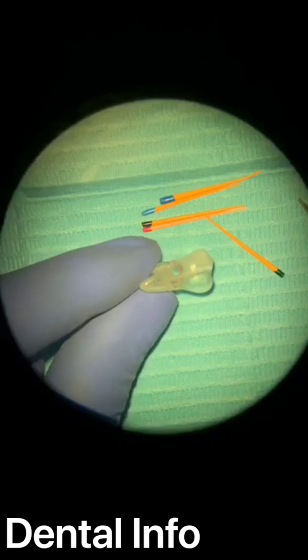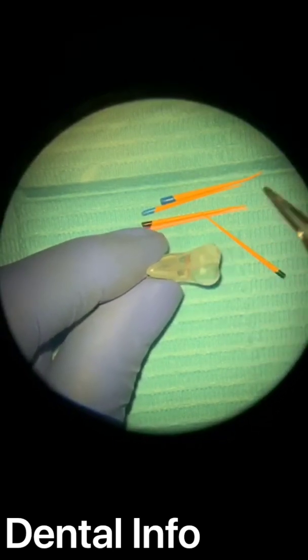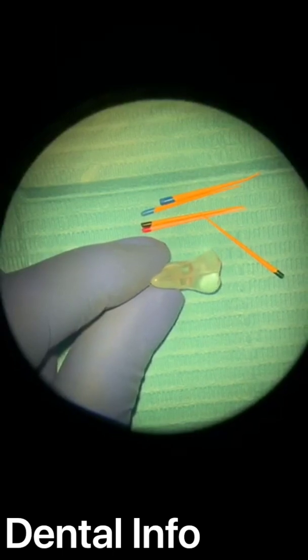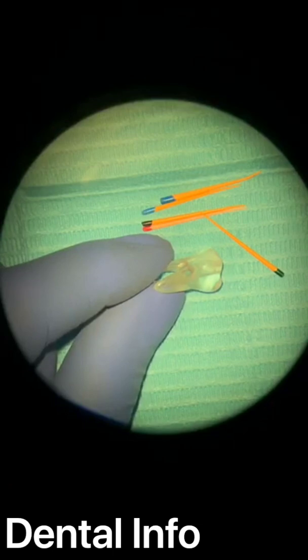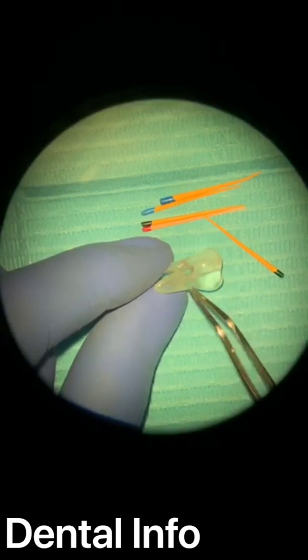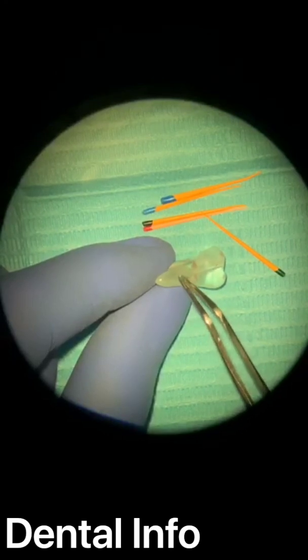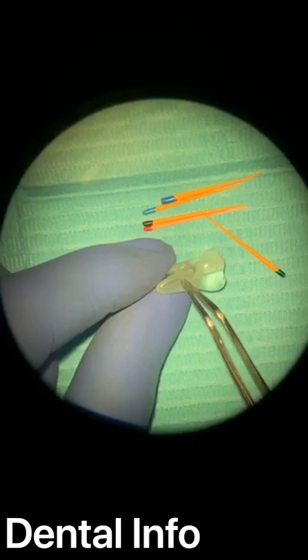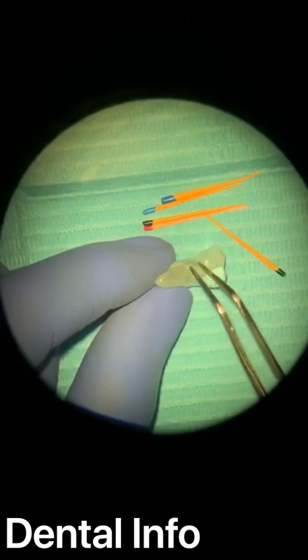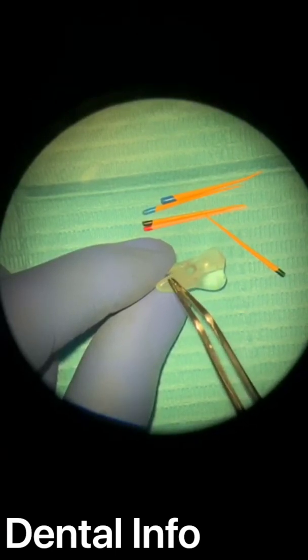I recommend always to keep the canal wet with the irrigant, with the sodium hypochlorite. Why? Because we have a lot of issues here. First one, to mimic that in the canal there is a sealer. So the sodium hypochlorite or the irrigant inside, whatever it is now, will be playing a role of tugback, of sealer.